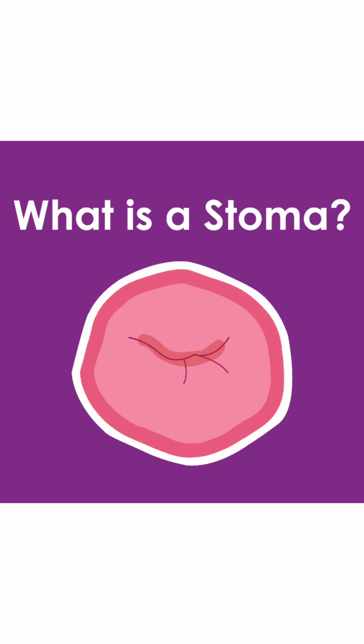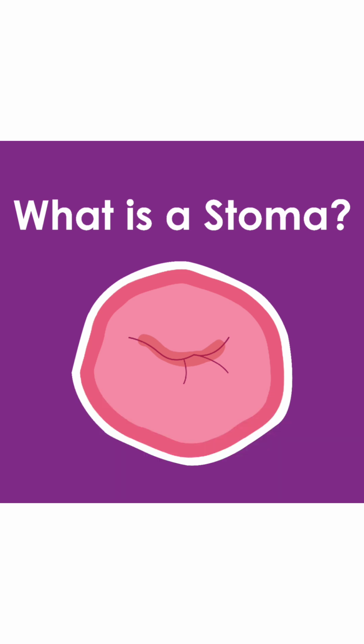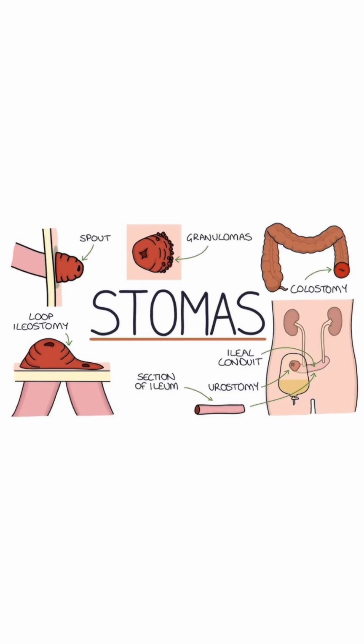Now, why is it essential to do the stoma care? The indications of doing the stoma care include to prevent infections and skin irritations. Then proper stoma care will ensure the stoma bag prevents leakage and functions properly.